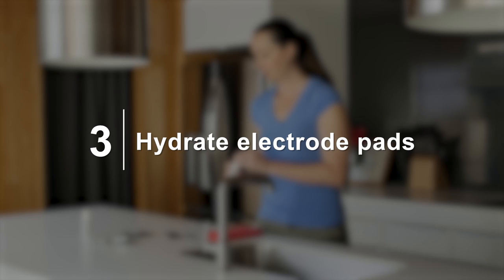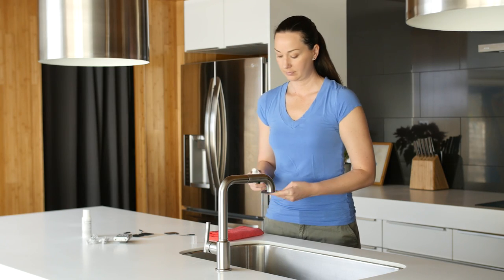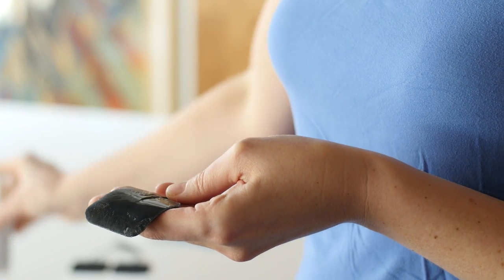Three: hydrate your electrode pads. We recommend using Eye Relief conductive gel and electrode spray to help hydrate and preserve the electrode pads, to extend their life and get maximum usage.